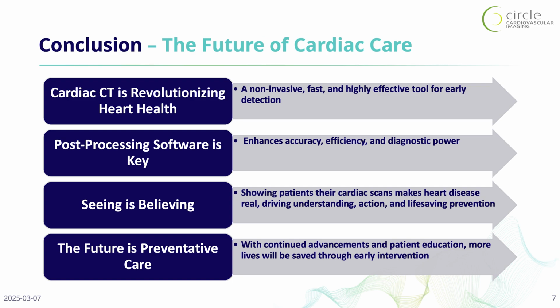Yeah, and I think it can't be overstated. You see how quickly these applications now allow you access to this information. And even with patient compliance, we always know that their compliance with medical treatment is very low. It's hard to put a patient on a drug and keep them on it consistently.